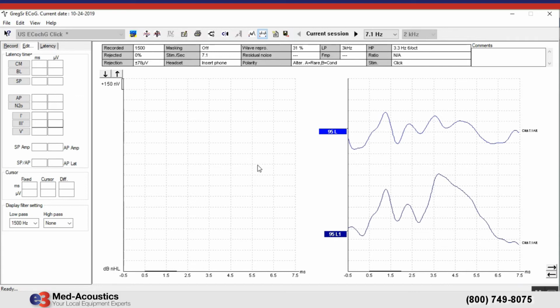And then this is the way that I mark the amplitude. Now we're just doing the amplitude ratio. And so I start with the action potential. That should be very obvious. And I mark the peak of that. Then I go to the summing potential, and there it is. Here it's on the leading edge of the action potential, but it's clearly there, and that's where I mark it. It takes a little bit of experience to know this, but that would be where I'd mark it.